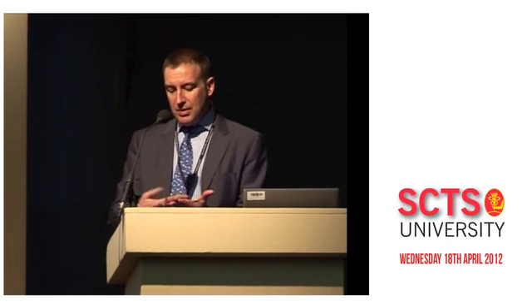hours of being in AF, I'm not talking 48 hours post-surgery, I'm talking at the point where they went into AF. And as we know, post-surgery, patients actually start to become quite prothrombotic quite early. So you've got a combination of atrial fibrillation, particularly if it's slow, maybe you've been treating it with amiodarone, and a patient who may be becoming prothrombotic. And I think TOE is so readily available to us. I mean, it's not so convenient if the patient's extubated.